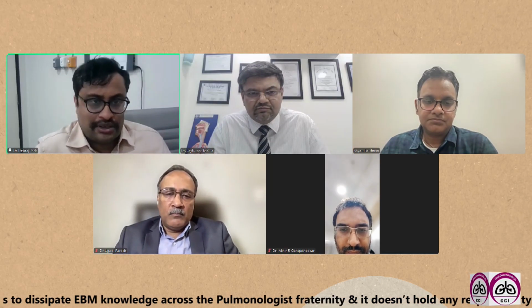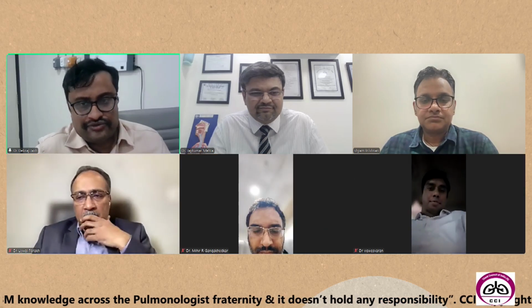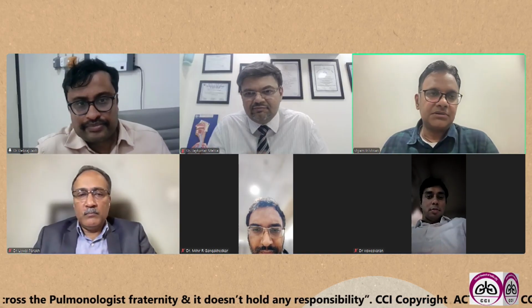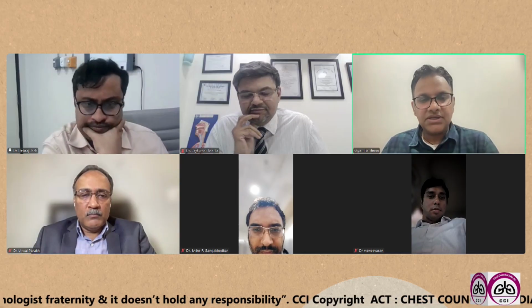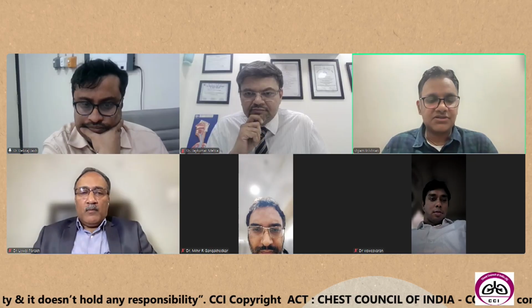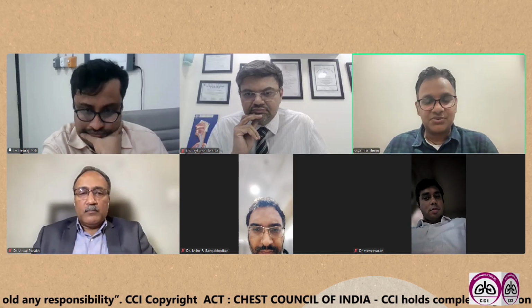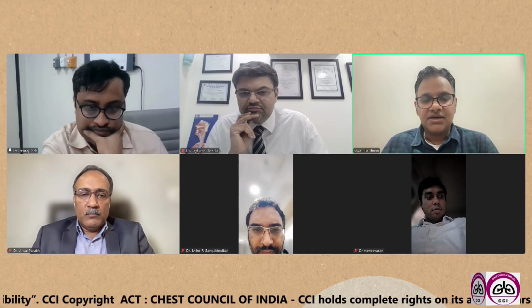Any experience of transvascular EBUS related complications? Any one of you? I've done about 3 or 4 in the last 2 years. But touch wood, if you follow the processes well, the patient has to be sedated and paralyzed. There's no question of attempting it under conscious sedation.